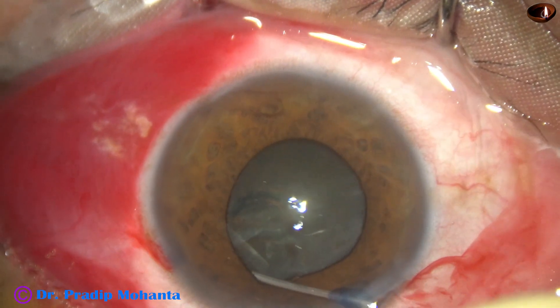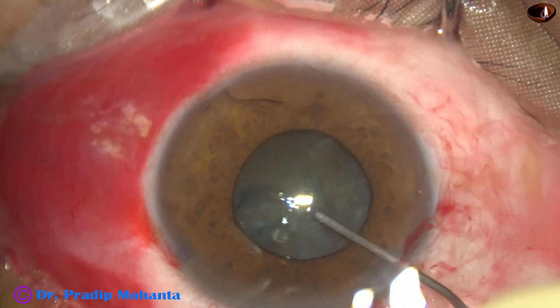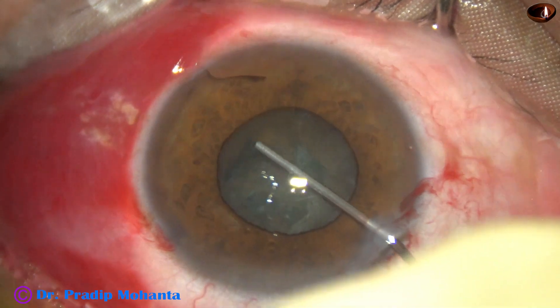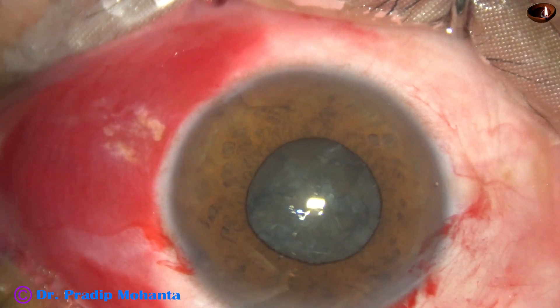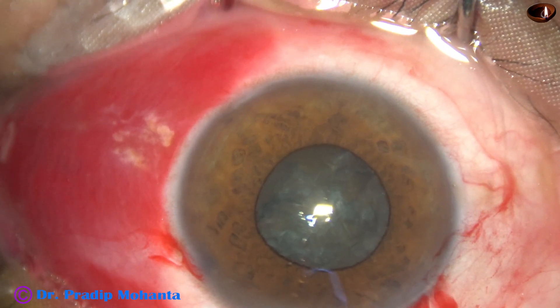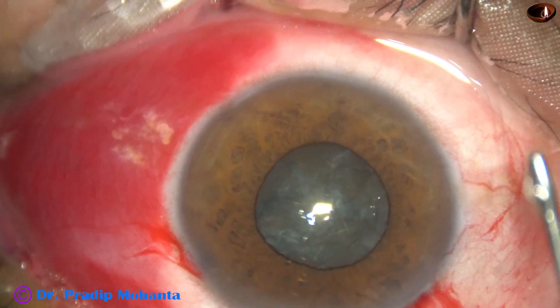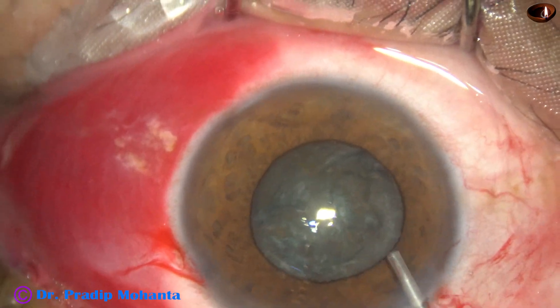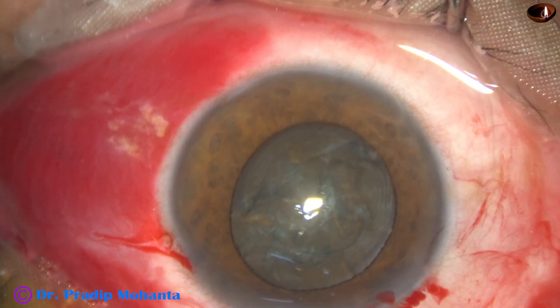I continue with hydrodissection and we can see that the iris is extremely floppy. It is going to be very difficult unless we use some other technique than what we do in such cases.